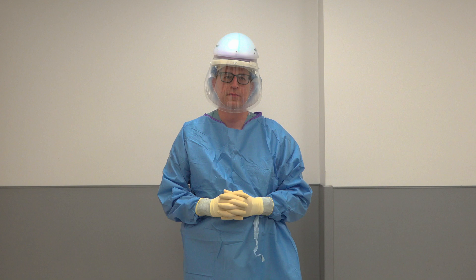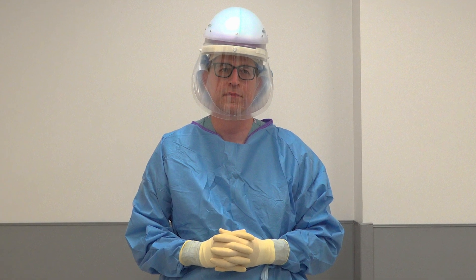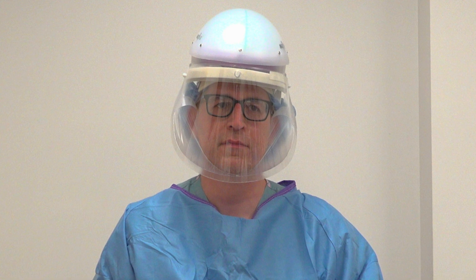This video demonstrates updated recommendations for proper donning and doffing of enhanced personal protective equipment for COVID-19 tracheostomy surgery. Note the standard sequence is modified in this case for a clean or clean-contaminated procedure where sterile technique is necessary.